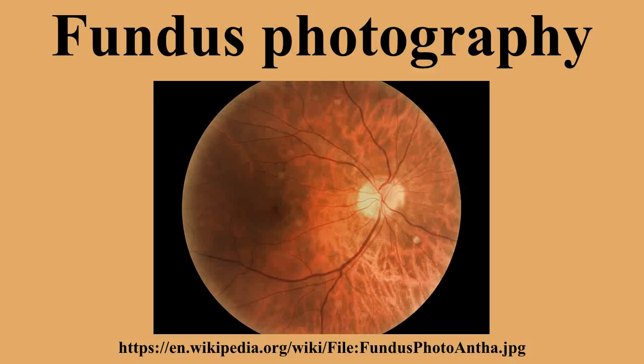Fundus photographs are also used to document abnormalities of disease processes affecting the eye, and/or to follow up on the progress of eye diseases such as diabetes, age-related macular degeneration, glaucoma, neoplasm of the choroid, cranial nerves, retinal or eyeball conditions, etc. In patients with diabetes mellitus, regular fundus screening examinations are important to screen for diabetic retinopathy, as visual loss due to diabetes can be prevented by retinal laser treatment if retinopathy is spotted early.